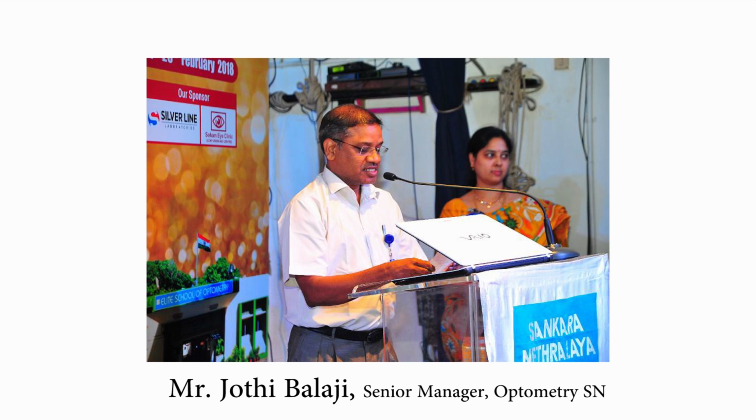What was the extent of myopia and what were the axial lengths you took? We categorized the myopia into 3. Actually, in the recent international myopia classification, there is nothing called moderate.